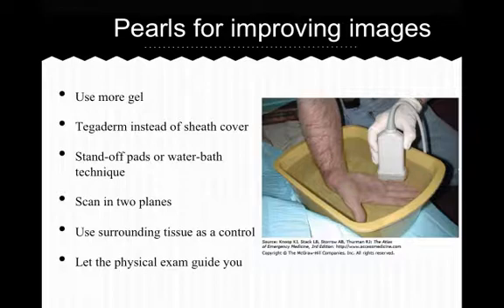For very superficial images, those less than half a centimeter deep, artifact can be a big issue, but you can combat this by either using a standoff pad or a water bath technique. And what this means is a standoff pad is a commercially available gel pad which conducts ultrasound well and can be placed over the skin to create some distance between the probe and area of interest. A half-liter bag of normal saline is an inexpensive substitute since water also conducts ultrasound well.